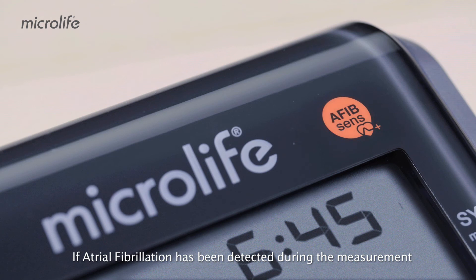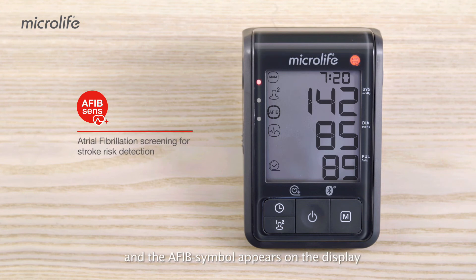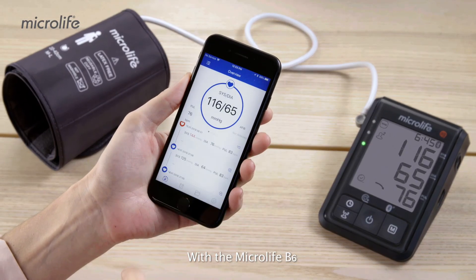If atrial fibrillation has been detected during the measurement, the AFib SENS indicator starts flashing and the AFib symbol appears on the display. We recommend that you discuss this with your doctor in order to lower your stroke risk.